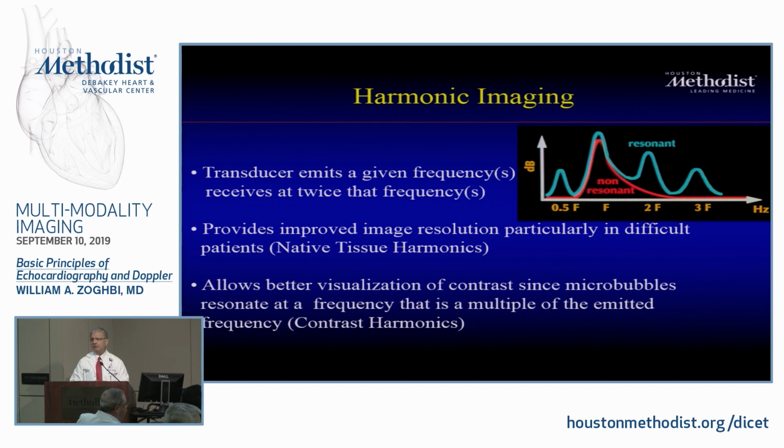What does it sound like? Well, I'm going to imitate it. I usually do imitate it here. If I send a frequency, bum, I'm staying at the same frequency, right? But if you do multiples of that frequency, the sound is distorted into multiples of those frequencies. It will be different frequencies, right? Some of them higher and some of them lower.